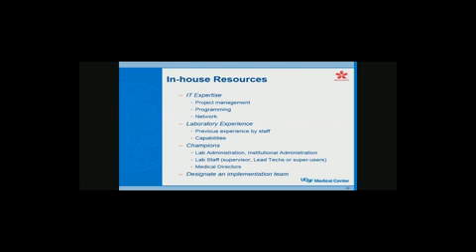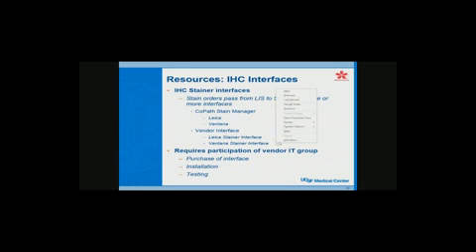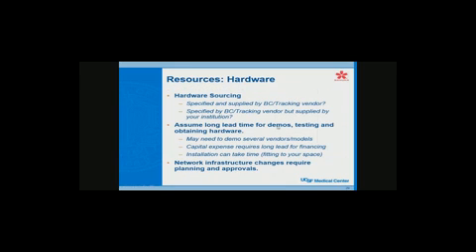And then you need your champions, of course. You need your lab administration, institutional administration. Everybody has to be on board with this happening. Especially your medical directors have to be there, because a lot of the end users are going to be pathologists that have to scan slides to show that they got the slides, or order stains in the system in a certain way. Everything has to be done in the system. It can't be all just word of mouth anymore. And then you have to put your team together and make sure they understand they're going to be working on this for many months, sometimes years.